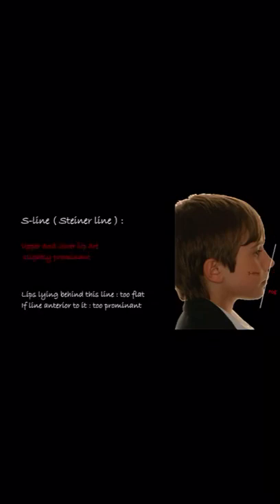Then we have the S line. If the lip lies behind this line, that means too flat, and if the lip is anterior to it, that means too prominent. So we can see in this patient the upper and lower lips are just slightly prominent.